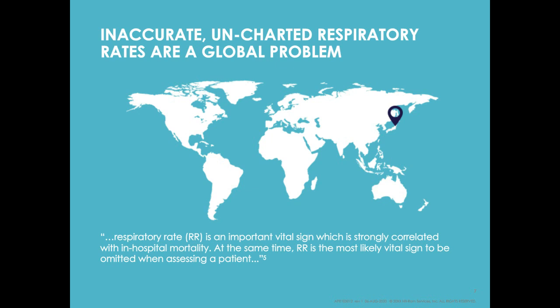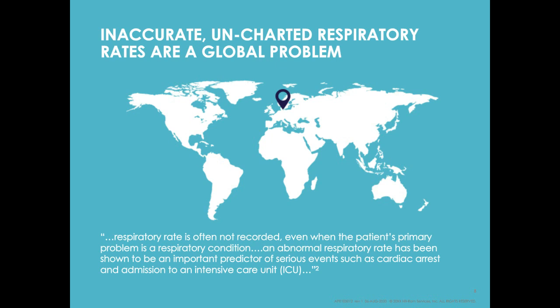A study conducted in Denmark also indicated that respiration rate is often not recorded. It stated, "Some argue that a reason for not measuring respiration rate is a lack of knowledge of its importance as a useful marker in assessing patients at risk of serious adverse events. Others suggest that it is not measured because there is no automated respiratory measuring device outside of the intensive care unit, and instead the pulse oximeter is used in assessing the respiratory state of patients. It therefore becomes challenging and time-consuming to measure respiration rate, making it more laborious and tempting to omit."